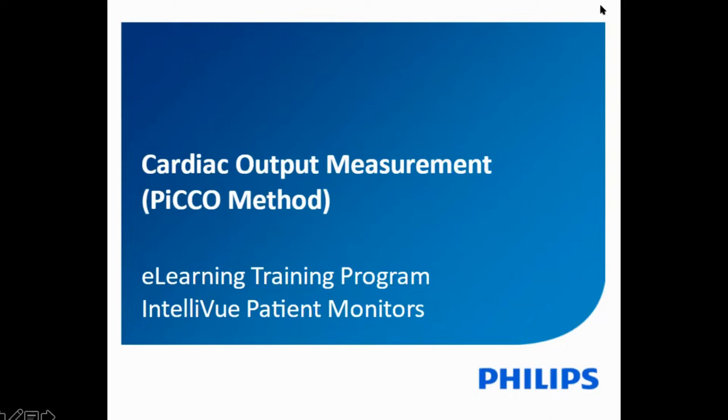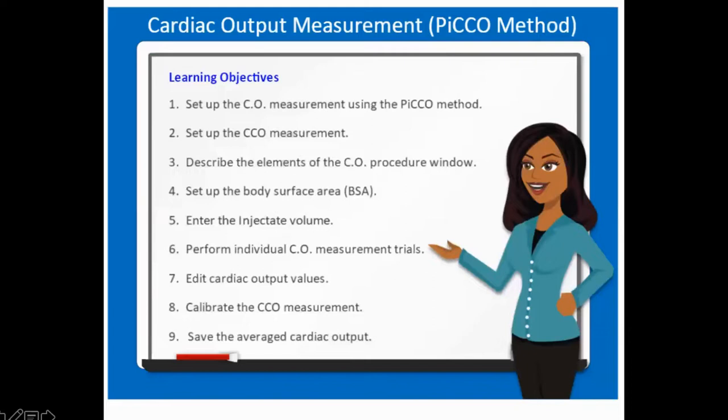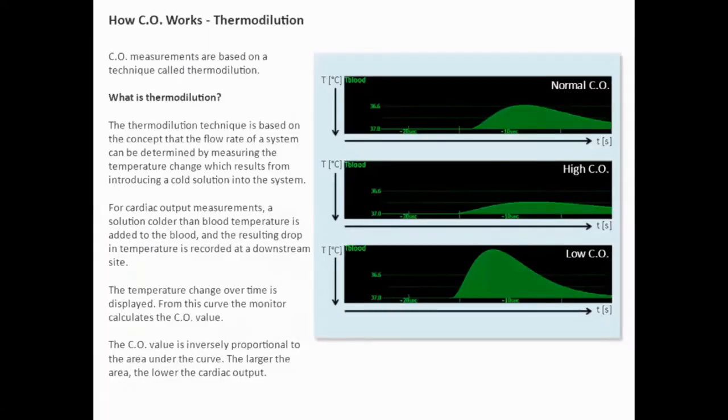First of all, let's see what cardiac output monitoring is, what PiCCO actually is. Cardiac output measurement is based on a technique called thermodilution. Thermodilution is a technique based on the concept that the flow rate of a system can be determined by measuring the temperature change which results from introducing a cold solution into the system.